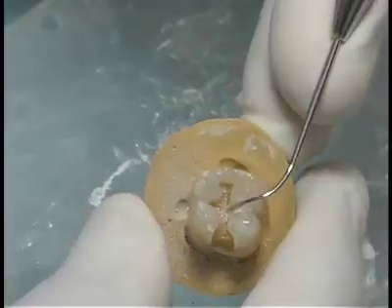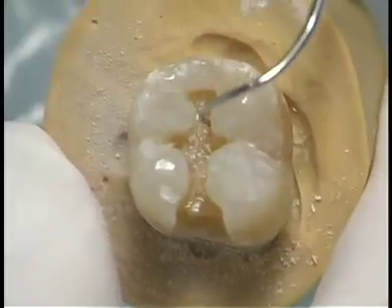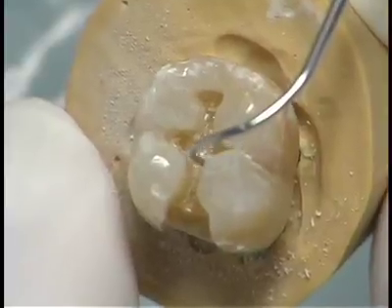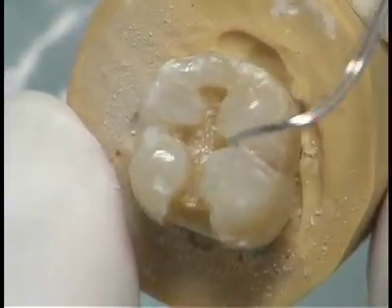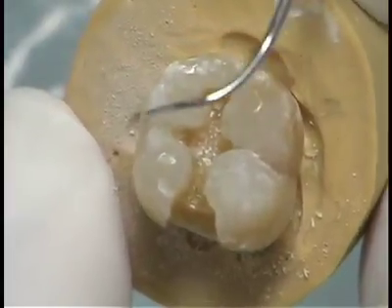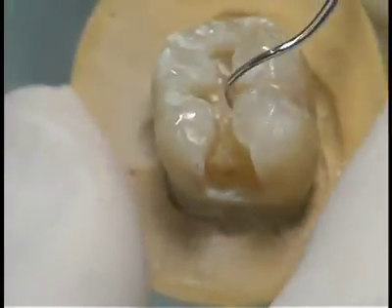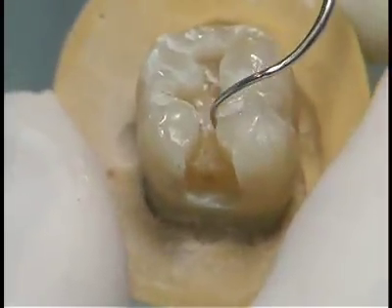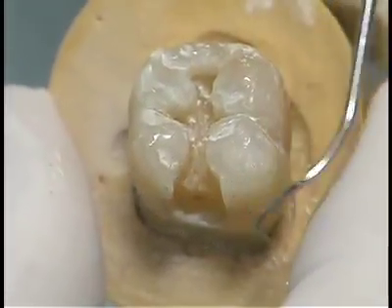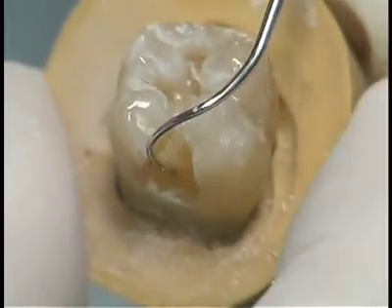To review, the occlusal segment was developed and the pulpal floor placed approximately 0.5 millimeters into dentin. All walls were connected with a smooth curve, and there are no catches in the groove area. There is now smooth and continuous flow of the preparation. The reverse curve was established. The axial wall was rounded to follow the external outline of the tooth structure and is 0.5 to 0.8 millimeters into the dentin.